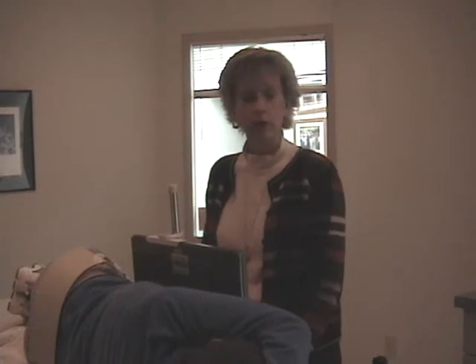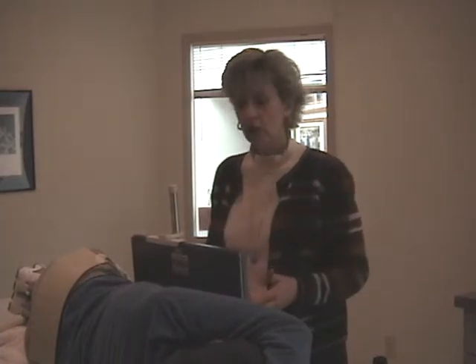Hello, class. We've set the room up today to demonstrate a decubitus chest. A routine chest has been performed in the near past, and they're suspecting some type of pathological condition. There might be fluid involved, there might be air involved in the lung. Decubitus chest means it's a chest, patient's lying on one of their sides, and you have a horizontal beam. So let's just take a look at the setup here.